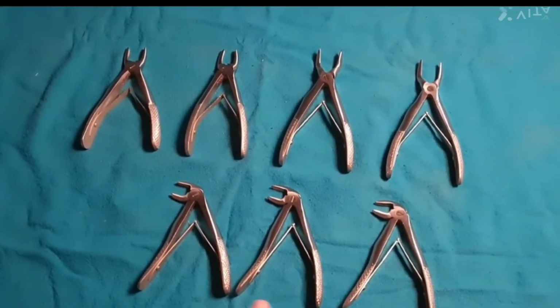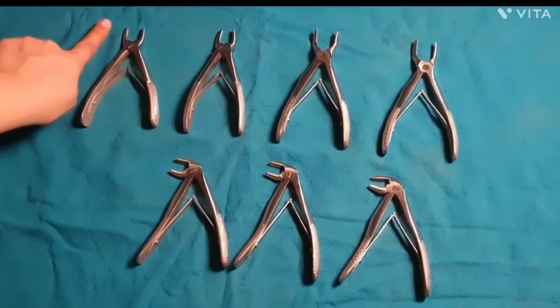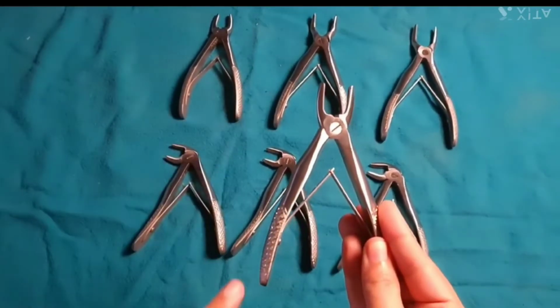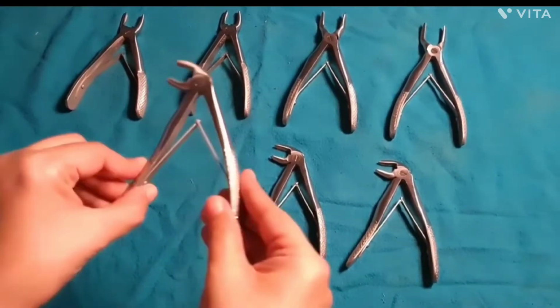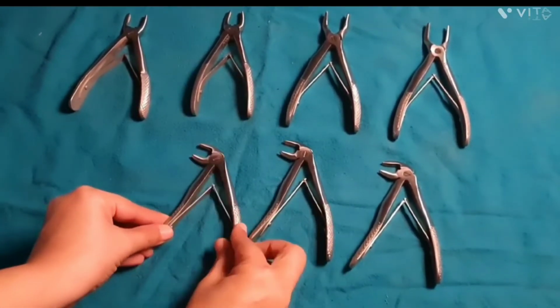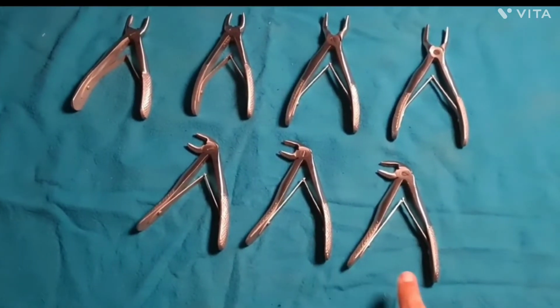You can easily distinguish upper and lower forceps, and upper forceps are straight. So you can see upper forceps, they are straight forceps, and the lower forceps, there is a bend in the lower forceps. So you can easily distinguish upper from the lower forceps.